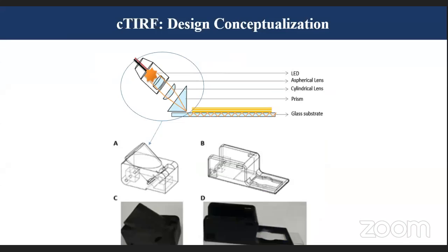So I started designing a cabinet around this setup, so that all the time this prism is in contact with this glass slab, and not only just in contact, but under a certain mechanical pressure, so that the light does not feel that air is in between, and goes the way we want it to go. And this should not be complicated to use by any normal person, or non-optical person, who can use it casually. So I started designing this device.